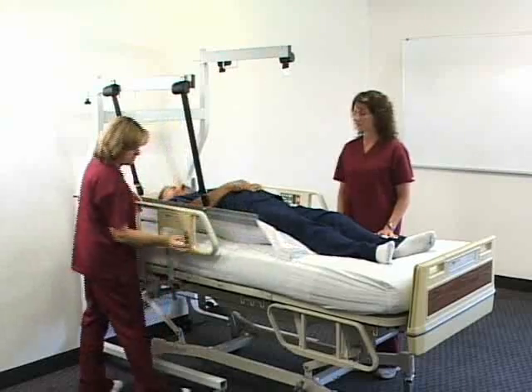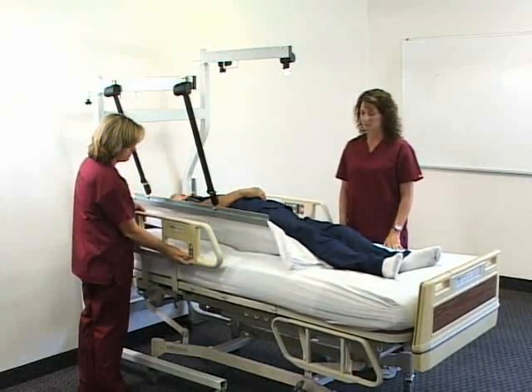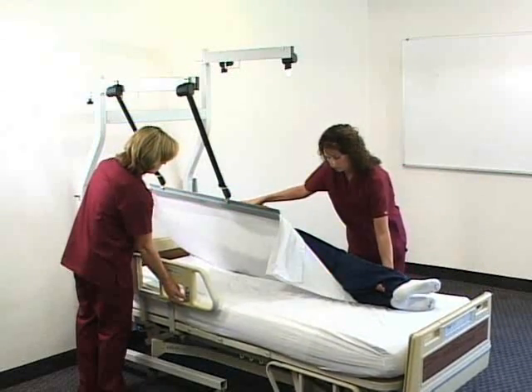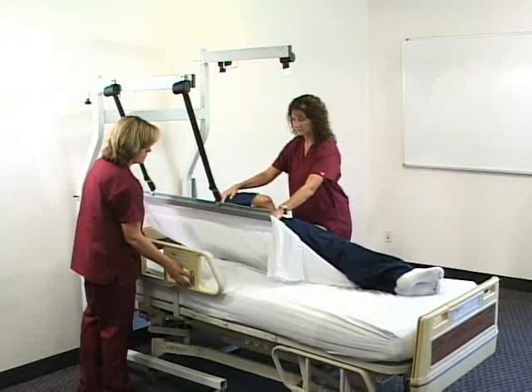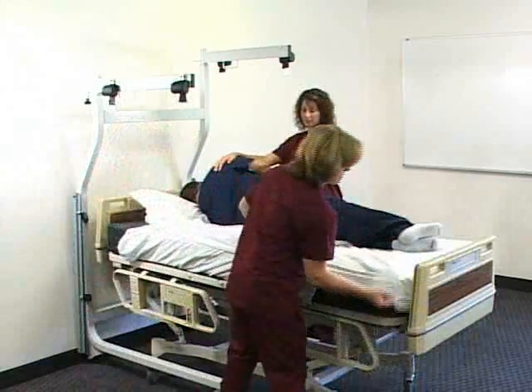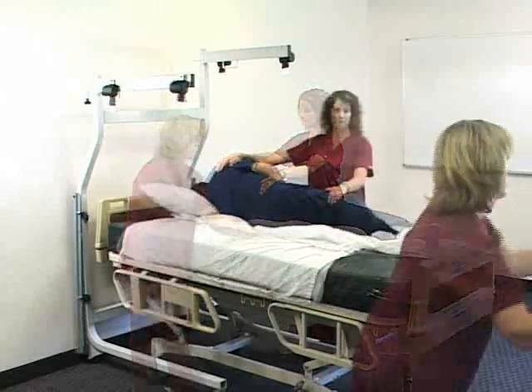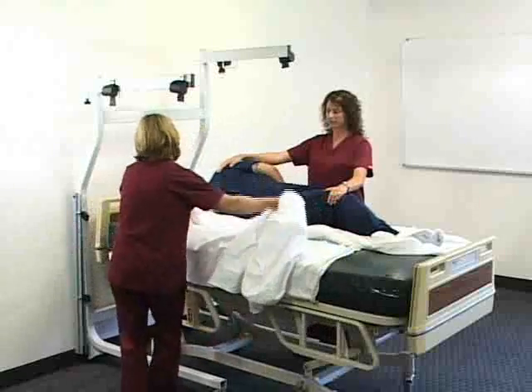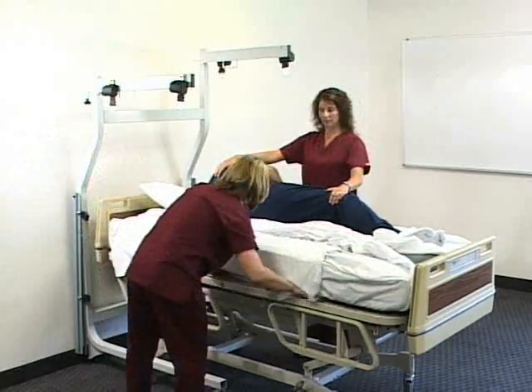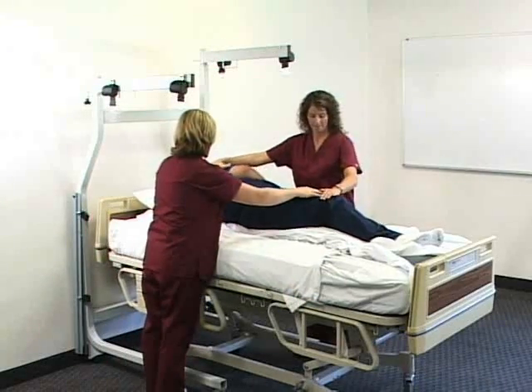The fabric clamp is attached to a draw sheet beneath the other linen. Lower the bed to turn the patient on his side. A second nurse may be needed to stabilize the patient on his side. Release the webbing and remove the clamp from that side of the bed. Roll the soiled linen next to the patient and spread clean linen next to him. Allow him to roll on his back on the lumps of linen.